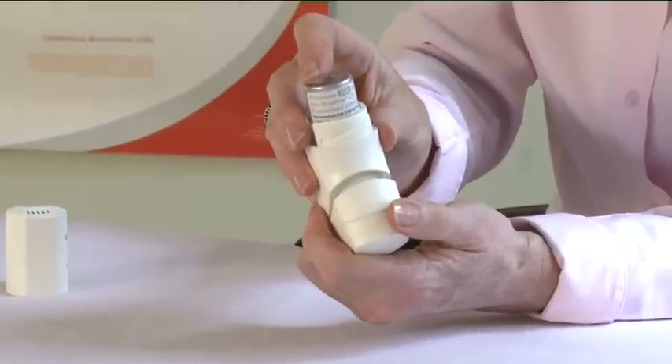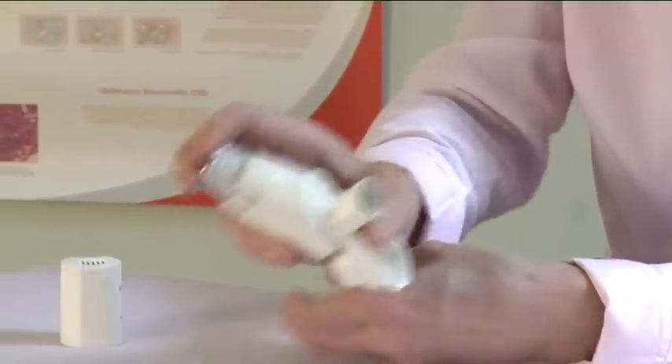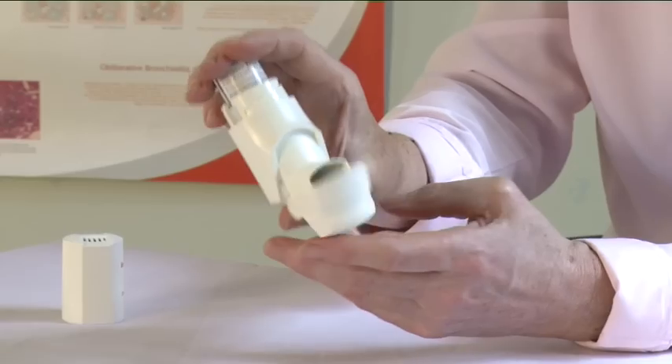Open the cap, shake the inhaler and spray the aerosol by pressing the can with your finger or thumb. Close the cap and put the top back on.